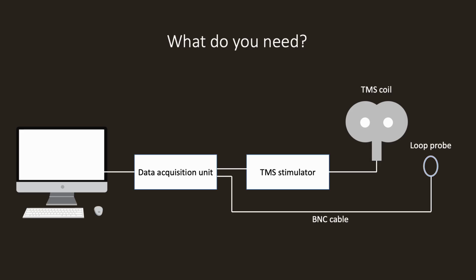What else do you need? We used a data acquisition unit connected to a TMS system and our loop probe, but you can also use a simple oscilloscope.